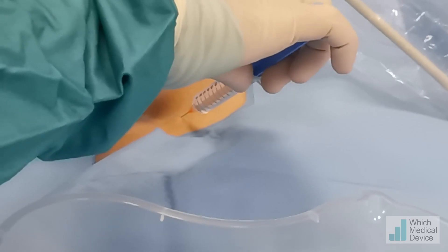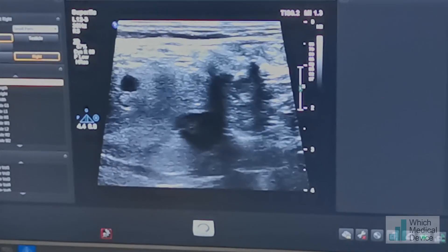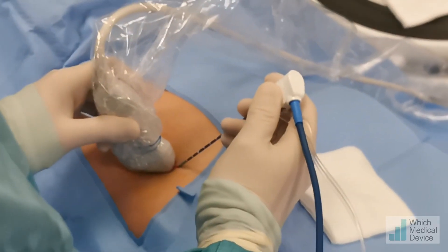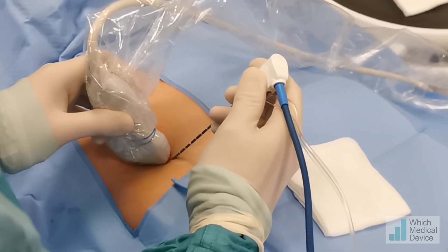Stinging — that's the local anesthetic. Let me know if I'm hurting you and I can give you more local anesthetic, OK?